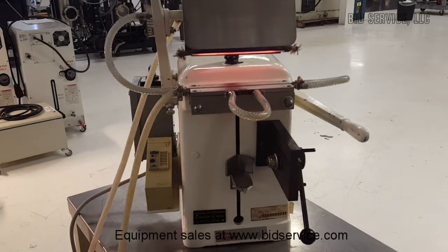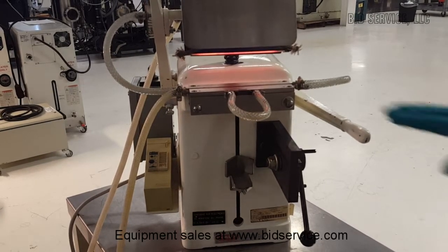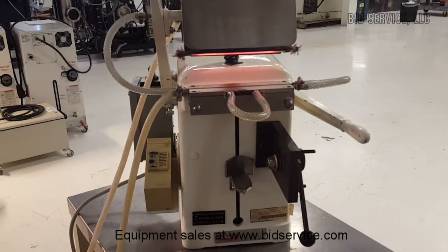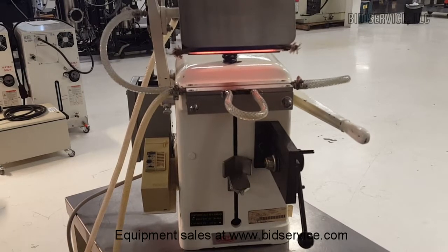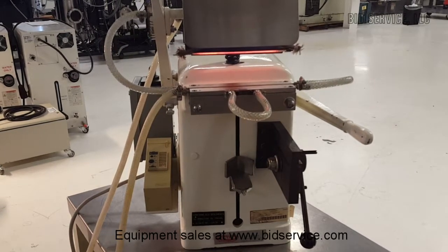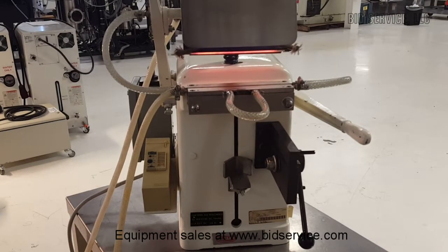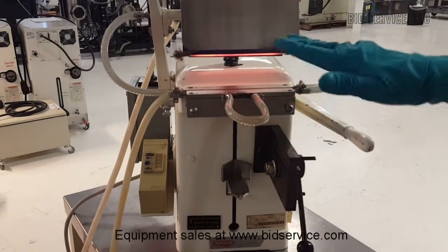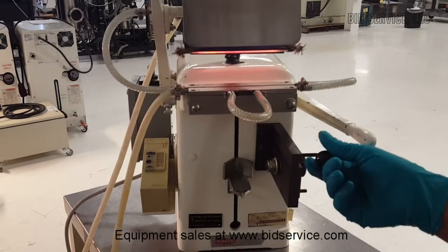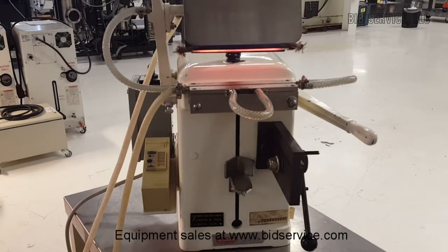So, special equipment are available for additional accessories for this system from the manufacturers. So please refer to the user manual for detailed parts and the applications. In addition to the sealing arrangement here, there is a cutter here which can be separated and used to cut certain kinds of tubes.